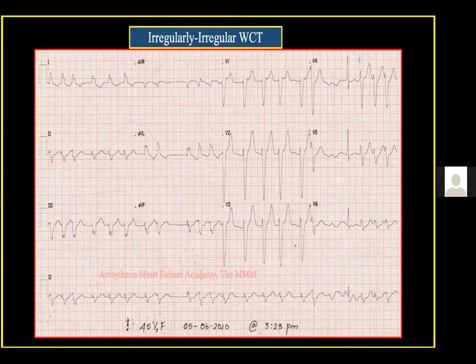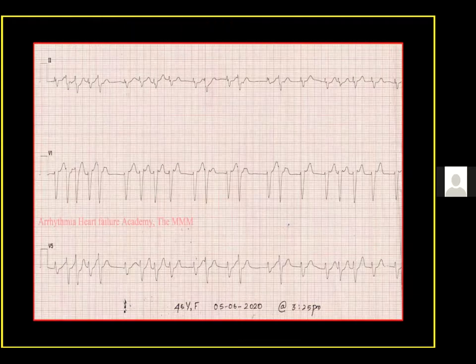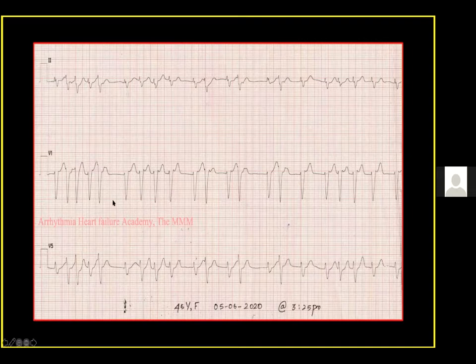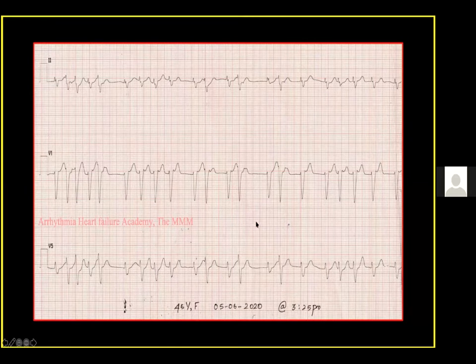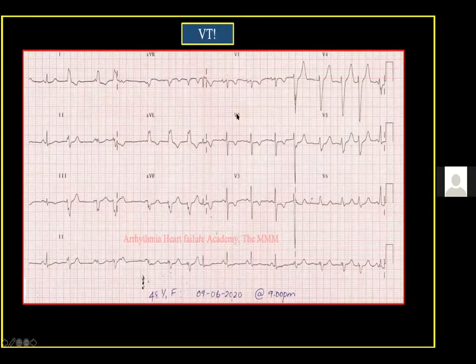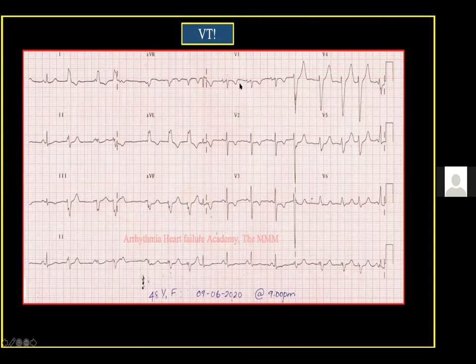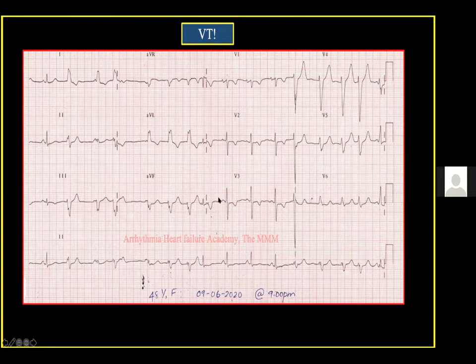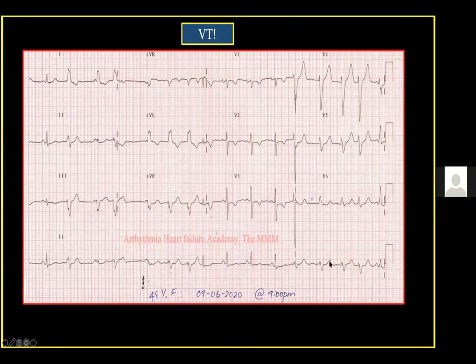I asked why, and he showed me this ECG. I still asked him why he didn't think so, and then he could point out a few things — maybe there are P-waves — but I was not convinced. Then this settled the issue: there are sinus beats. T-wave inversion, maybe part of LBBB T-wave memory. The narrow QRS sinus beats are at least seen, and whenever a wide QRS comes up it appears not preceded by a P-wave — it looks like a PVC.